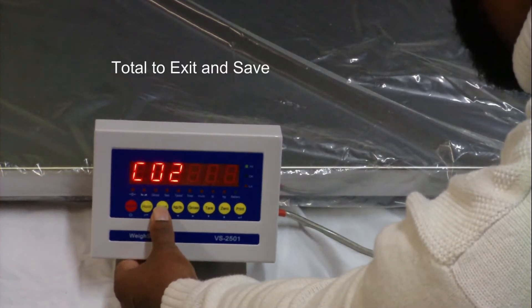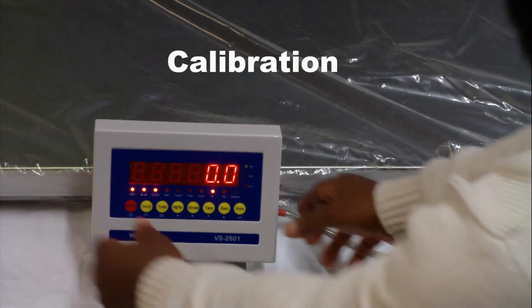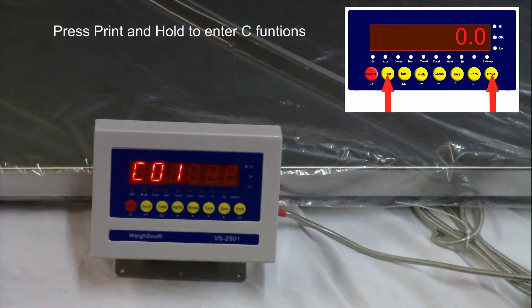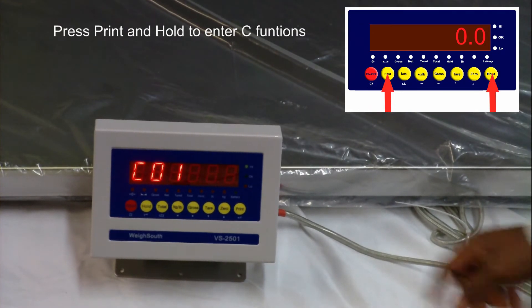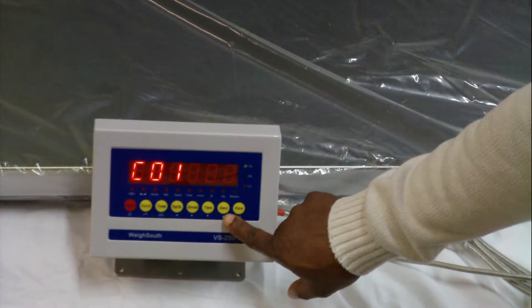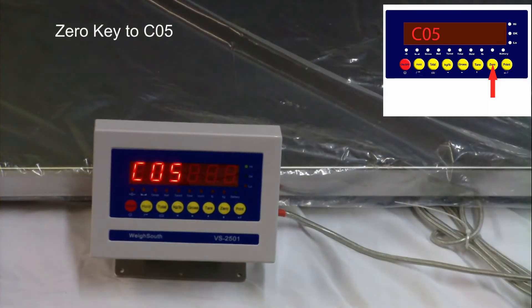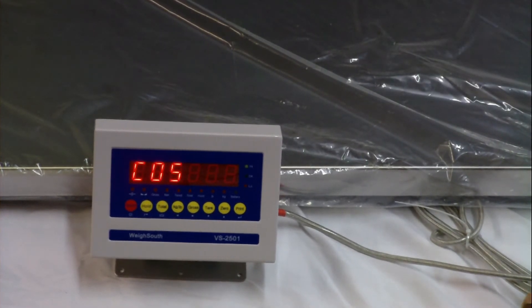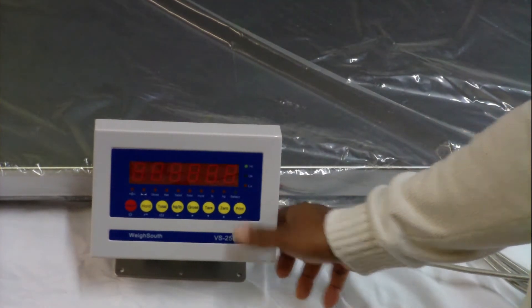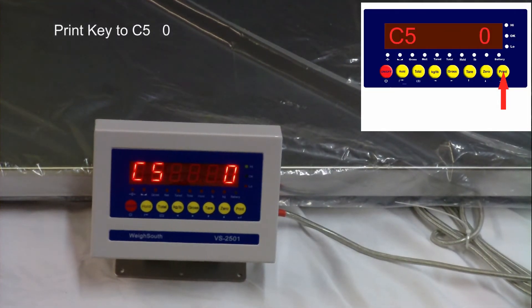For calibration, we will be using C function 5 and C function 6. Begin by entering the C functions of the 2501 as stated earlier. You need to enter the C submenu. Enter C05 submenu by pressing the print key. Your display will now show C5 0.